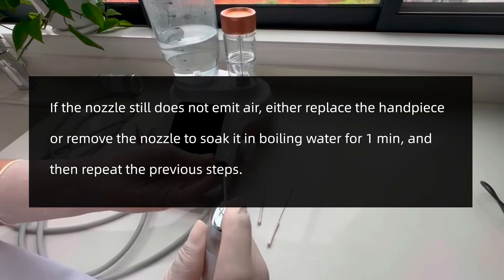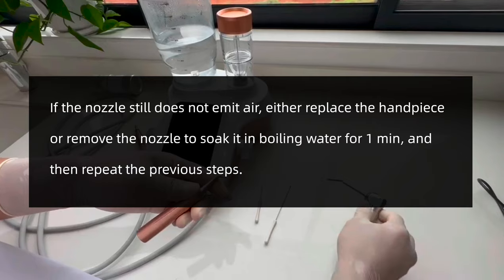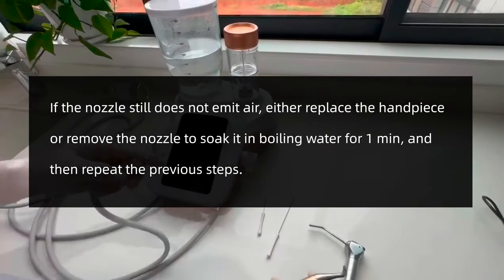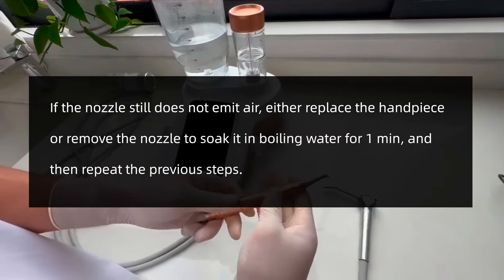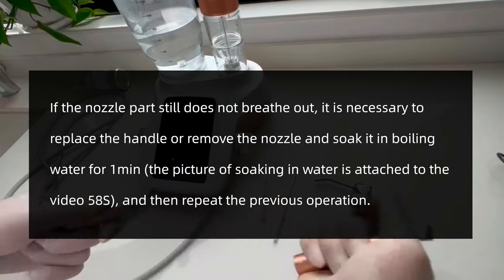If the nozzle still does not emit air, either replace the handpiece or remove the nozzle to soak it in boiling water for one minute, and then repeat the previous steps.